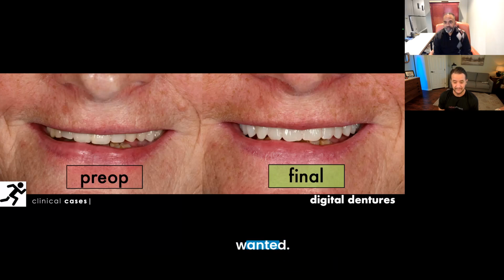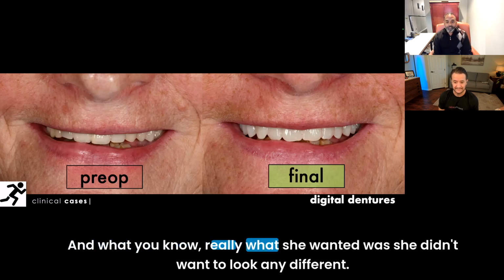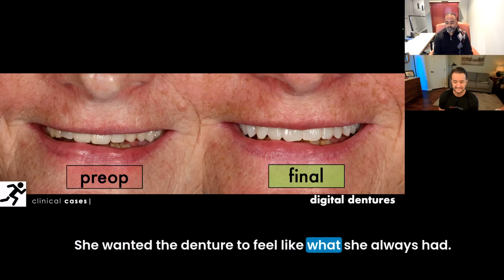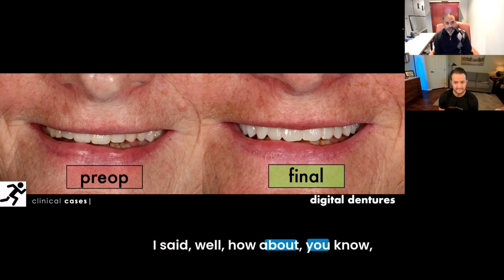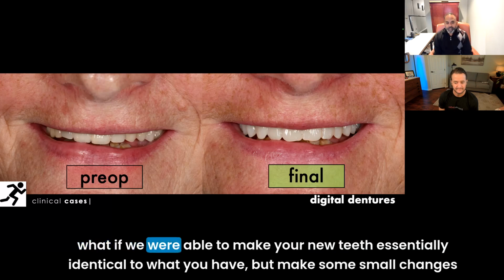that's what she wanted. Yeah, and really what she wanted was she didn't want to look any different. She wanted the denture to feel like what she always had. She just wanted a new version of it. I said, well, what if we were able to make your new teeth essentially identical to what you have, but make some small changes and improvements?